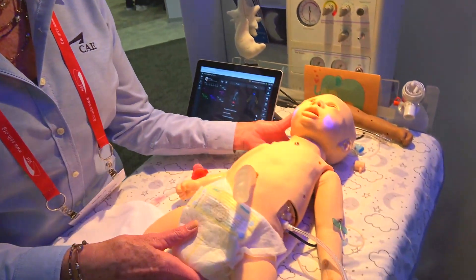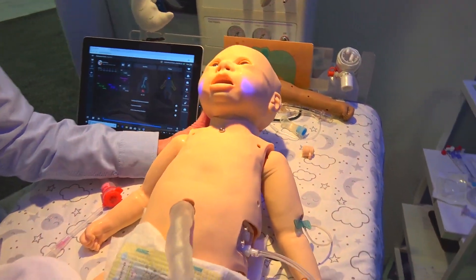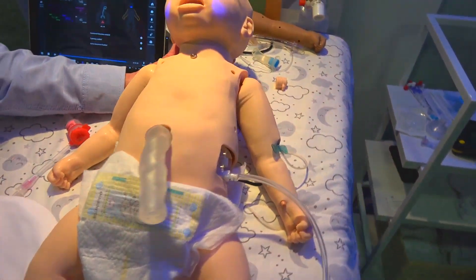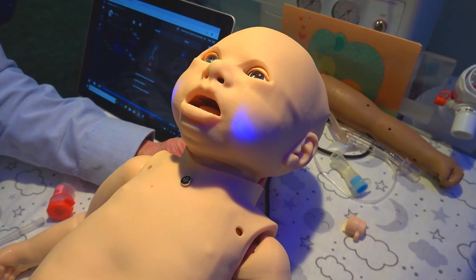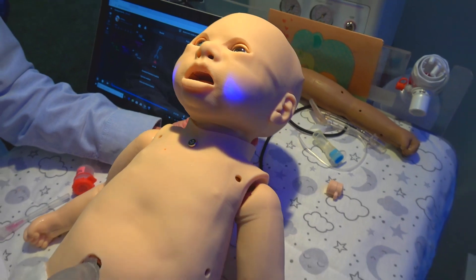I'm Wendy Jo Wilkinson, product manager for CAE. We're here live at IMSH 2019 and I'm going to tell you about Luna. This is our new newborn mannequin, newborn to 28-day size. Luna comes in three configurations: base, live, and advanced, depending on the learning needs of your learner.